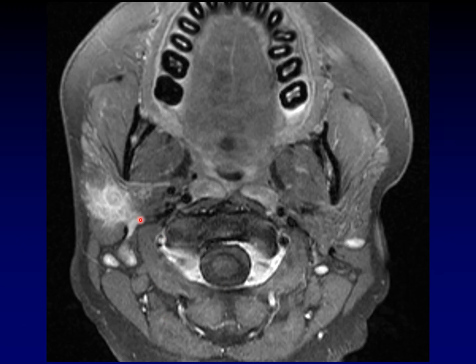I found this quite worrisome. In addition to salivary malignancies, I was worried about rhabdomyosarcoma, because I always worry about that in children with masses anywhere near the skull base. This infiltrative look here — very concerning.